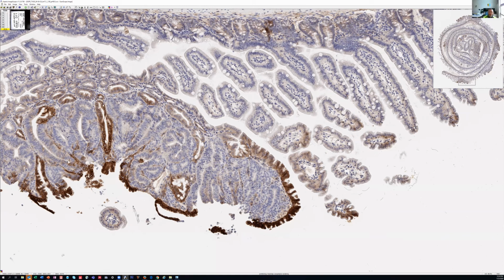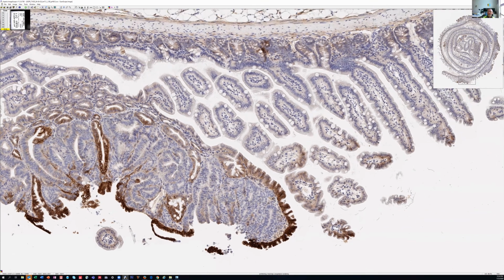I guess I would expect that some adenomas, but not all adenomas, would have increased EGFR. And I think this is very interesting because you can see a little bit of EGFR in your crypts, right, which probably goes along with proliferation a bit. But you're getting much more in the reactive stuff that's stretched over the top, and it does beg the question of what those cells are that are able to persist over the top.